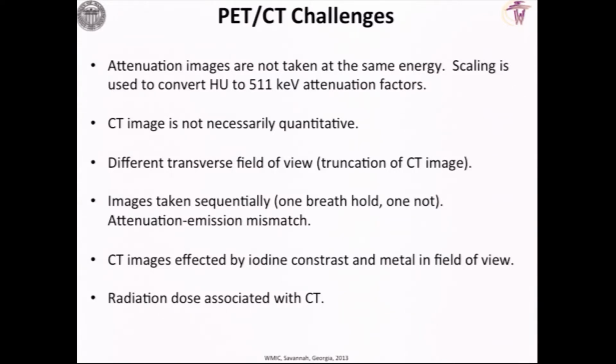So you have to scale to convert the Hounsfield units to the PET attenuation factors. The CT image isn't necessarily quantitative. You're not dealing with a single energy source anymore, so the actual Hounsfield numbers are not super quantitative.